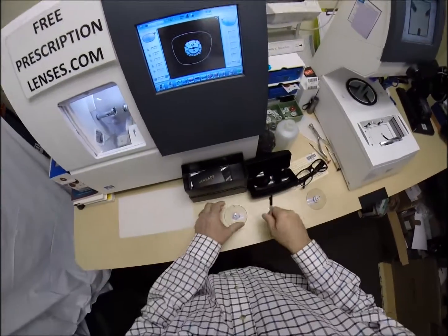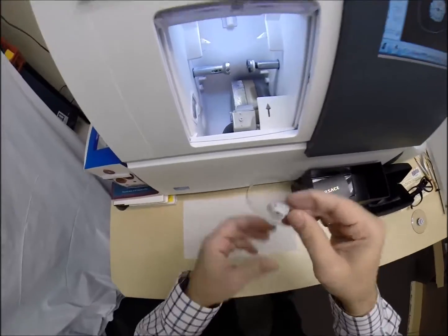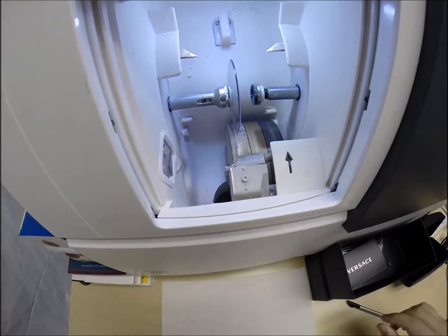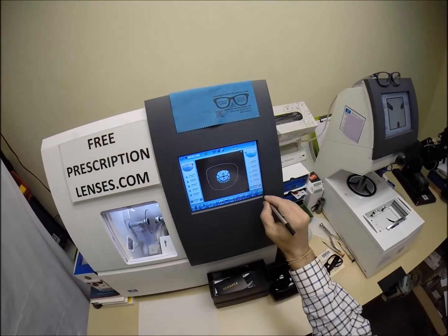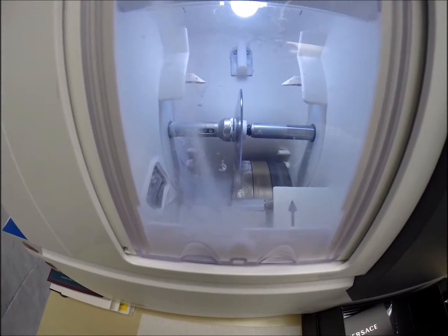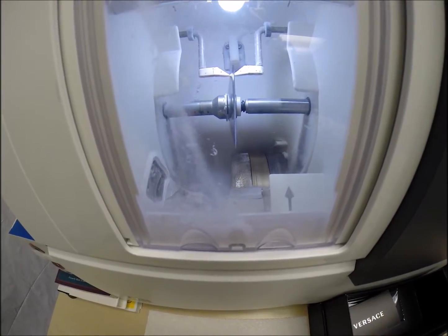There we go, polycarbonate. So now the magnet is going to do its job a second time today. It's going to attach itself to another magnet there in the chuck, or as I like to call it, the Charles, because I don't know this machine well enough to call it chuck. Hit the green arrow, which is start in every language. The door closes, the clamp shuts, and then the lens is going to be traced by 2 white styluses, making sure that the lens is large enough to fit into the frame.